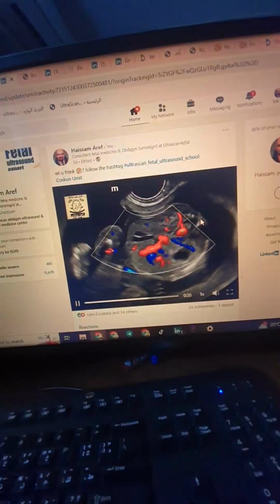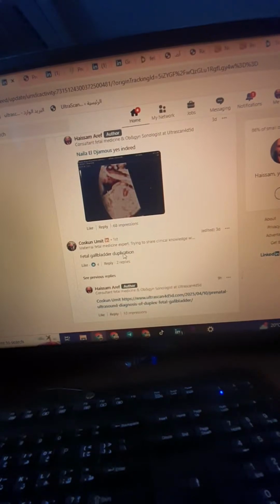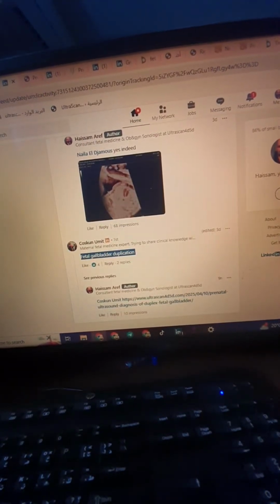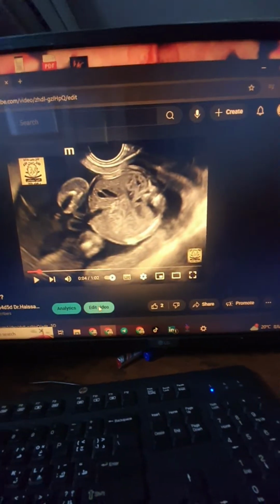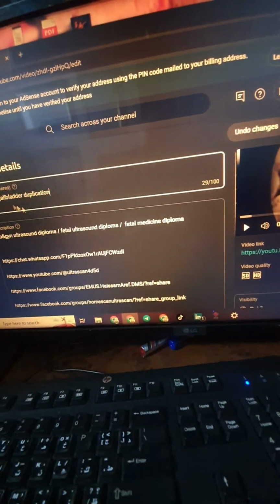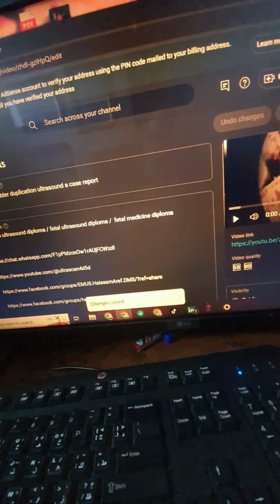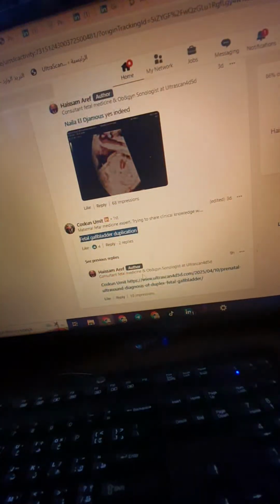Okay, so we saw this one, and we will write the comment, fetal gallbladder duplication, in our YouTube channel, because this is a Hall of Fame. It's very important to change it in our description, like this: fetal gallbladder duplication ultrasound. It's a case report, and I don't think anybody depicted it like this before. Okay, let's go back, my friends, and see other cases.